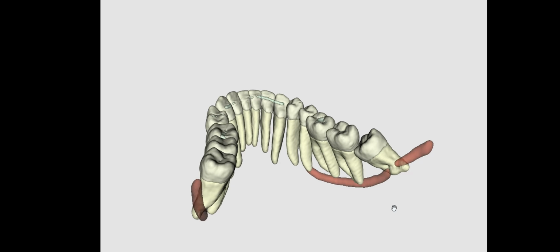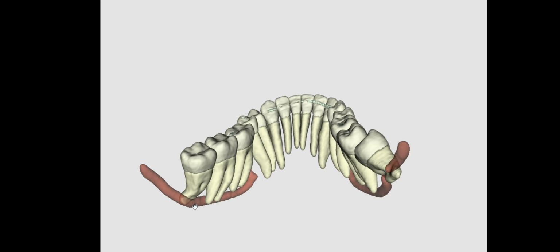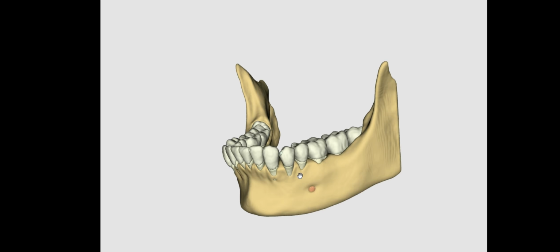So with this knowledge in mind, we can approach the surgery, understand what directions are important in regards to delivering force and things like that, to try and minimize the risk of damage to these nerves, because damage to the nerve can result in alteration of the sensation in the lower lip and the skin below the lip down to the chin, so that vicinity there.